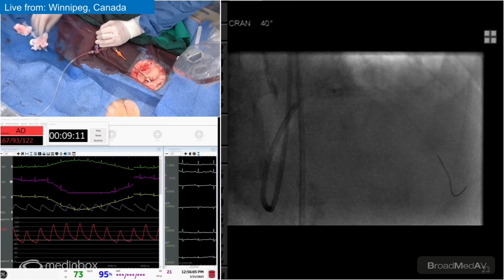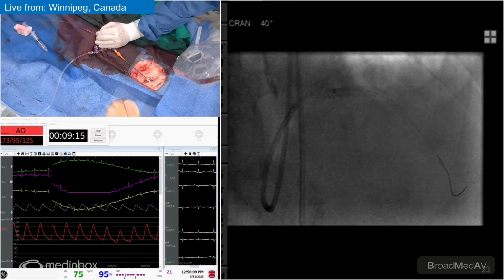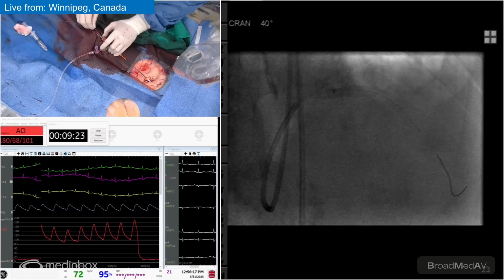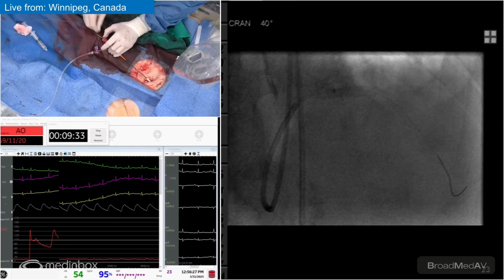I think you're right. I think you just had tip fatigue. This should go nicely. This is the third time you've used the other one now. So I don't traumatize it in any way, shape, or form. Goes in nice and smooth. I got it. Let's see.